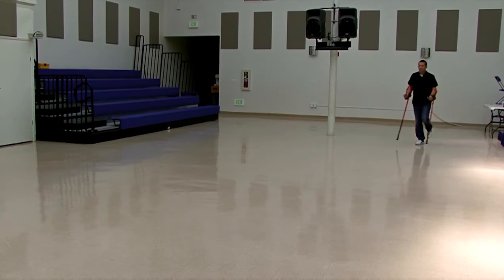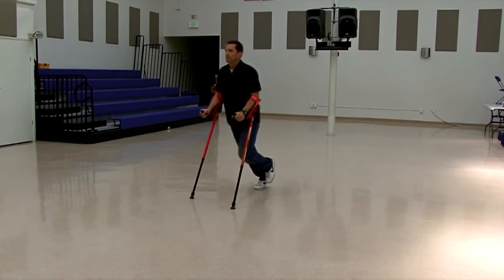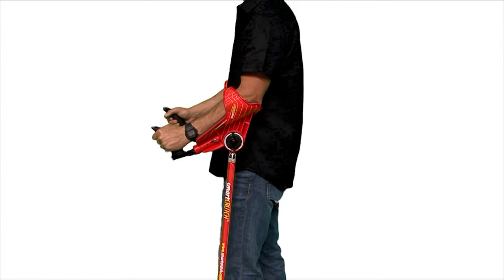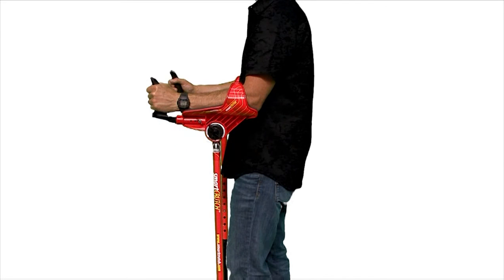If you are using smartCRUTCH for non-weight-bearing use, that is where you are not able to put weight on a specific leg, setting position number 1, as initially recommended, will offer the most stable feel. Once you become familiarized and comfortable on your new crutches, or if you have previous experience using forearm-style crutches, then you can go ahead and experiment with new angle settings to meet your personal requirements.